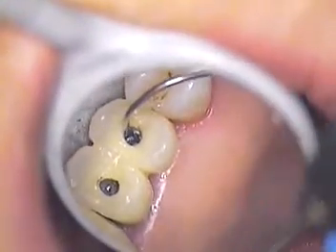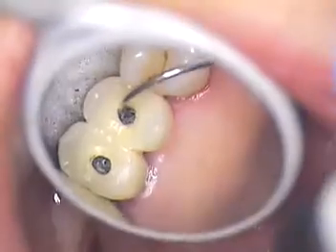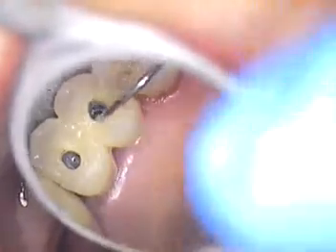We notice that it turns and continually turns. Turn it some more, and more debris gets pushed up to the top.